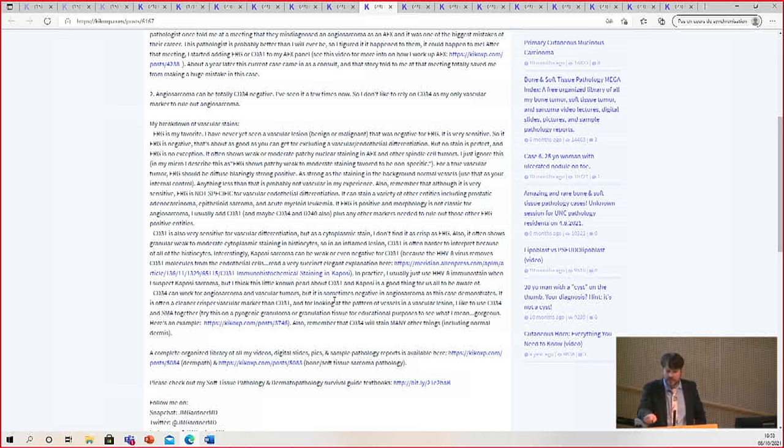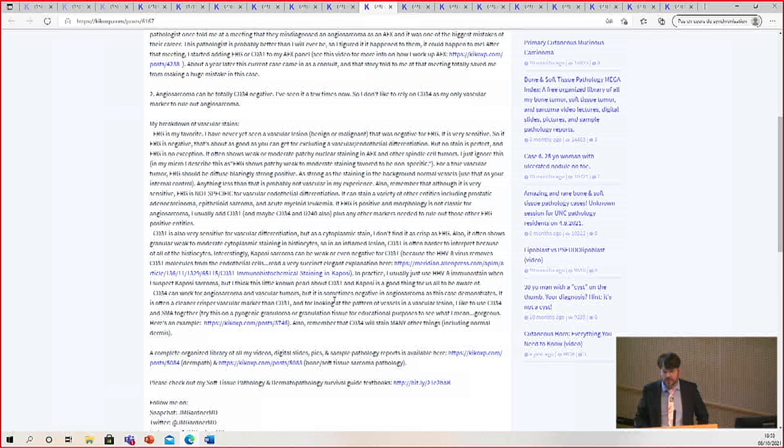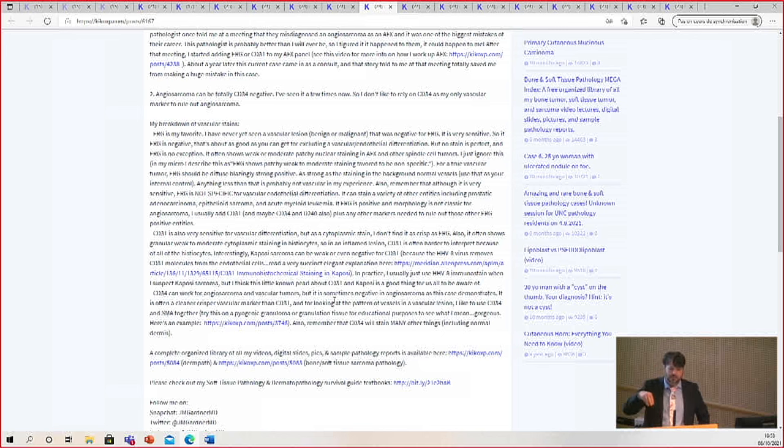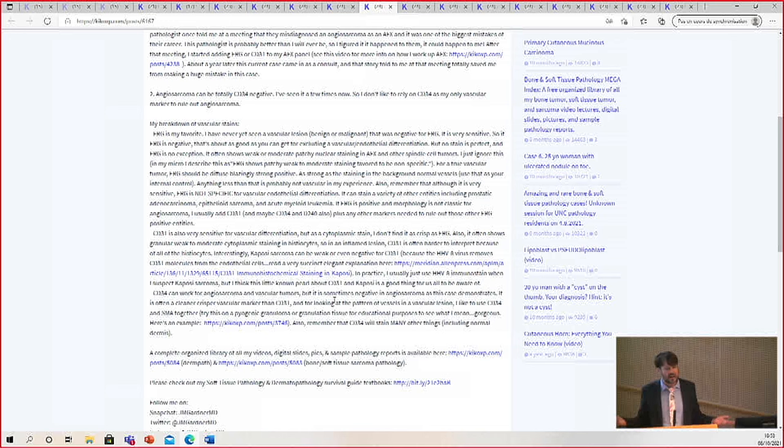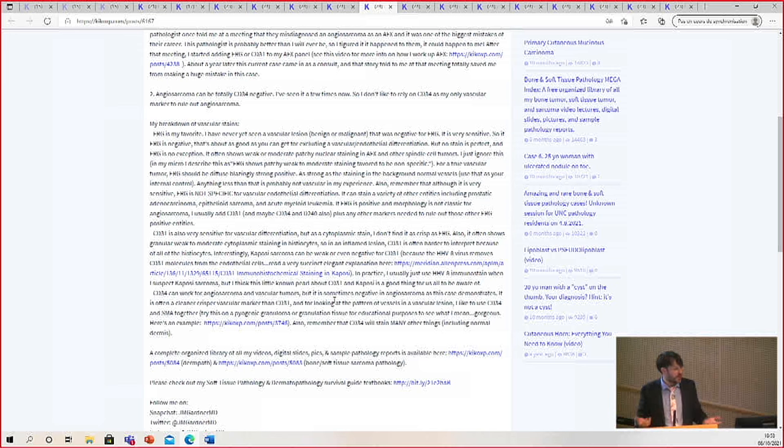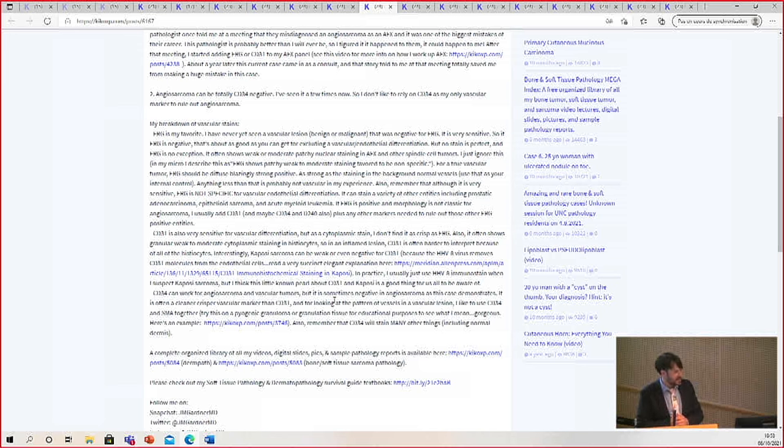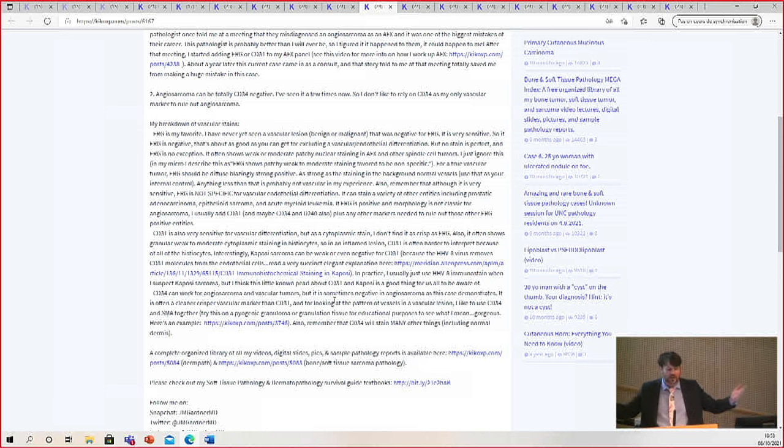And there's a really nice paper here about why that is - that human herpes virus 8 actually down-regulates expression of the CD31 molecule, which I thought was really fascinating. I realized because I was trained in the era of HHV-8 immunostaining, we had HHV-8 ever since I was a trainee. So if I wonder if something's Kaposi sarcoma, I don't do vascular markers. I just stain it for HHV-8, and if it's positive, it's Kaposi sarcoma. Easy.